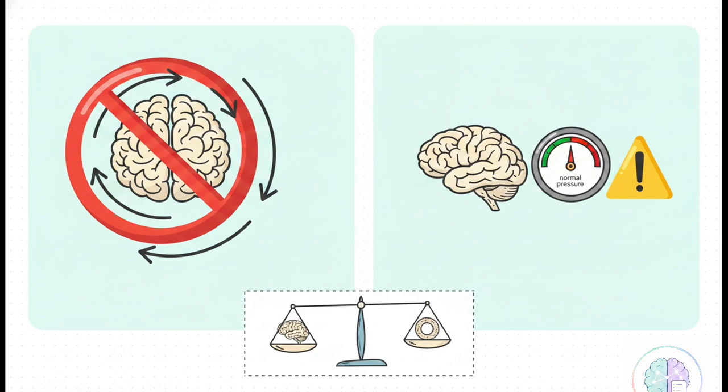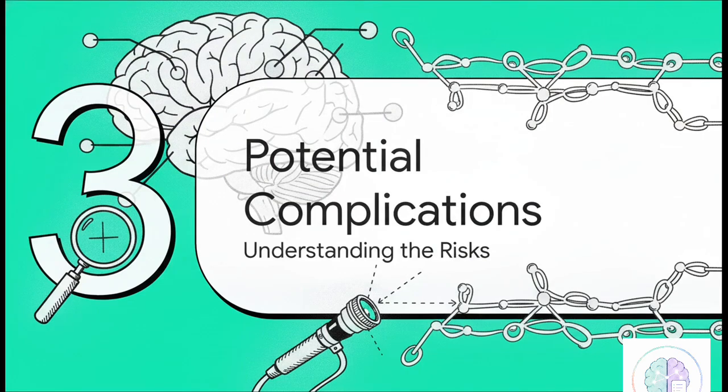You also always have to weigh the scales of pre-existing conditions. Any underlying pathology that's known to have a low baseline success rate acts as a relative contraindication. It forces the surgeon to ask a tough question. Is this stoma actually going to stay open? Next up is Section 3, Potential Complications. Let's really unpack the risks involved here.